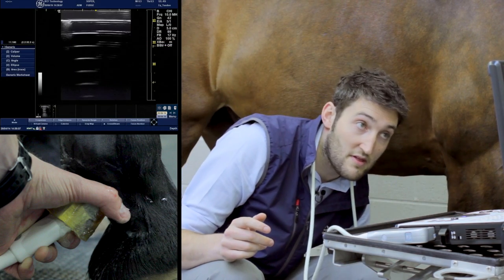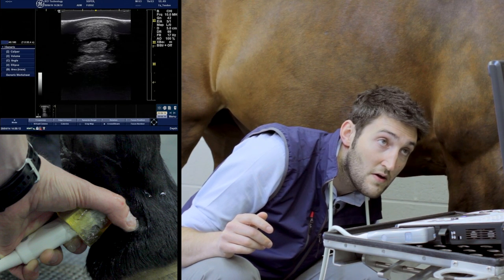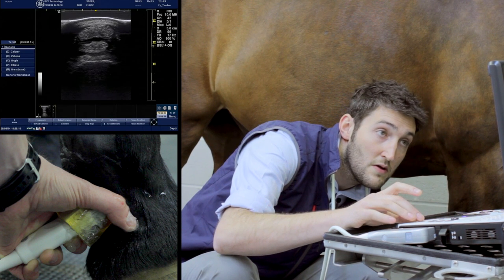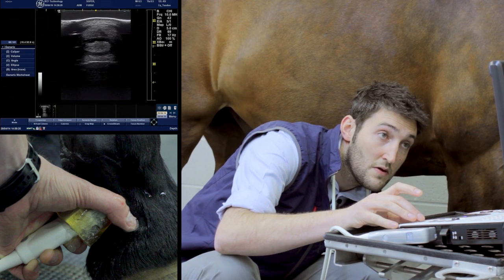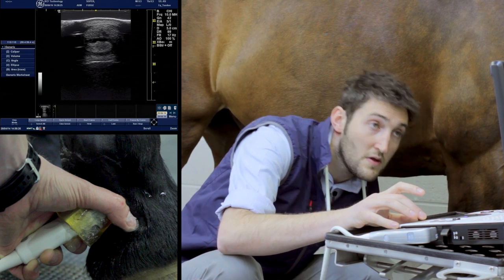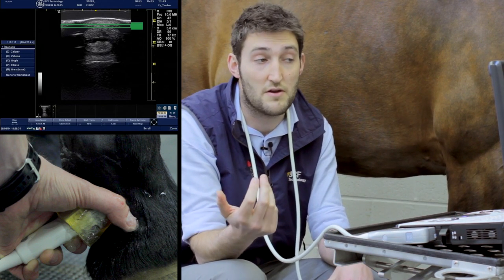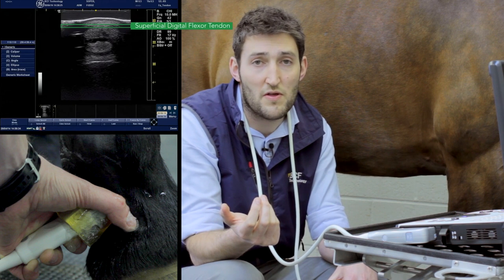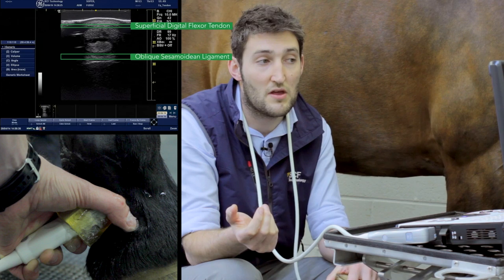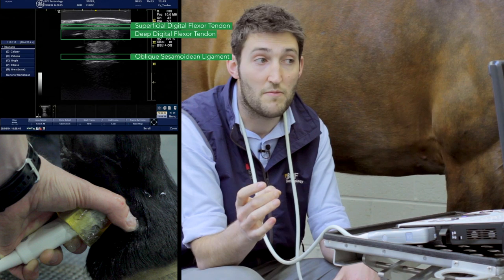Coming down to zone 1C, we can see that the superficial digital flexor tendon has all but gone, and also that the oblique sesamoidean ligaments are all but gone as well. The deep digital flexor tendon at this stage is also starting to separate into two separate lobes.